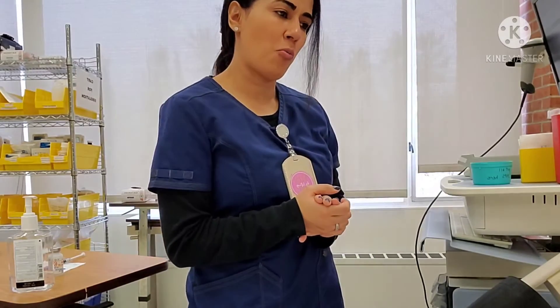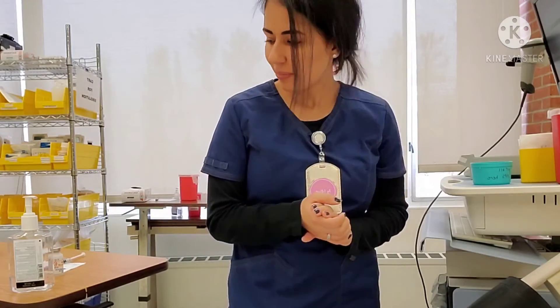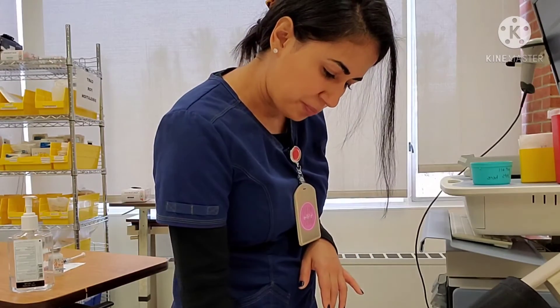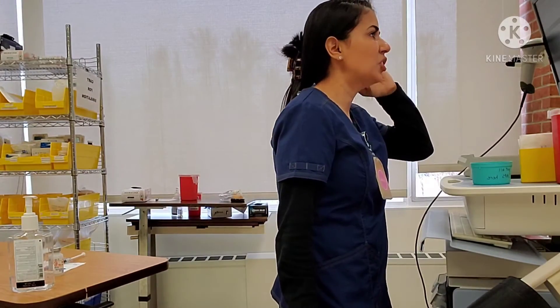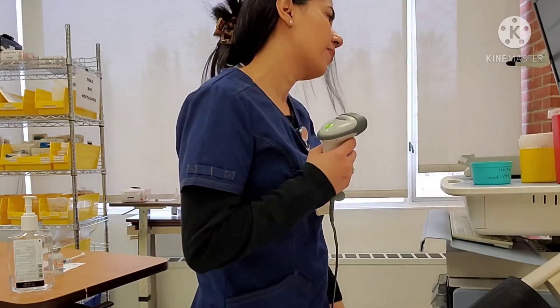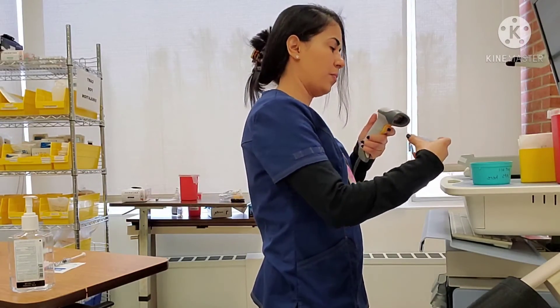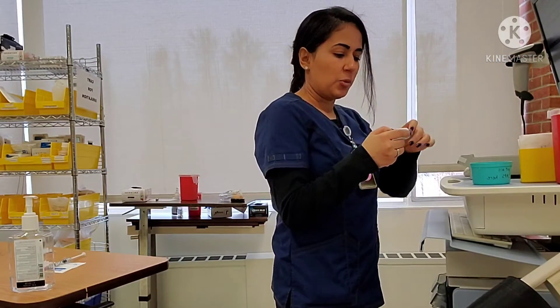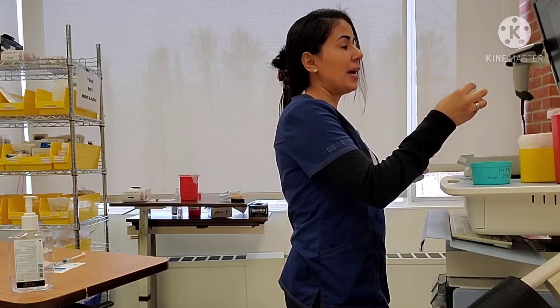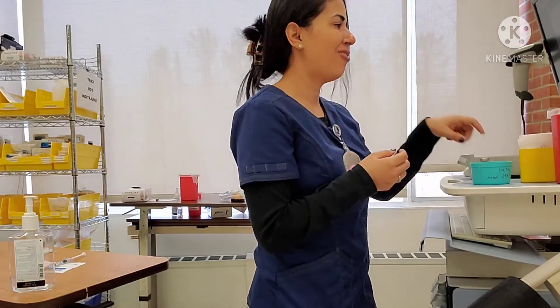The provider has said that by tomorrow morning we'll be able to get you out of bed and work with physical therapy. Can you confirm again your name and date of birth? Zach Morris — that matches, and your birthday also matches. I'm going to scan your bracelet and scan my heparin. The expiration date is good, the liquid looks good, and I see I have heparin 5,000 units per one milliliter. I want to administer one milliliter. Everything checks out.